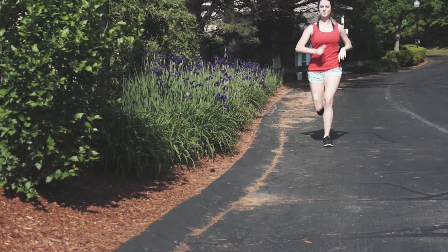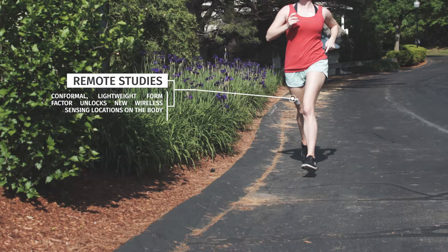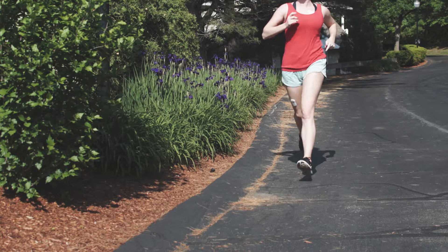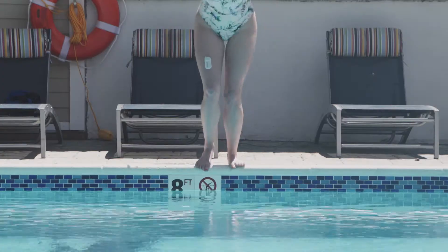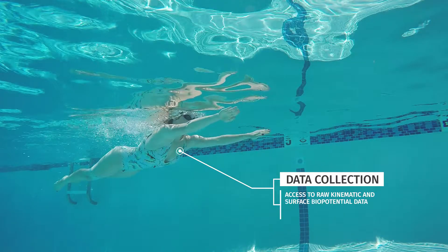The Biostamp Endpoint system centers on soft, flexible, conformal Biostamp sensors that can be worn up to 24 hours at a time anywhere on the body for targeted data collection. Onboard memory stores the data locally, allowing study execution in a variety of settings.